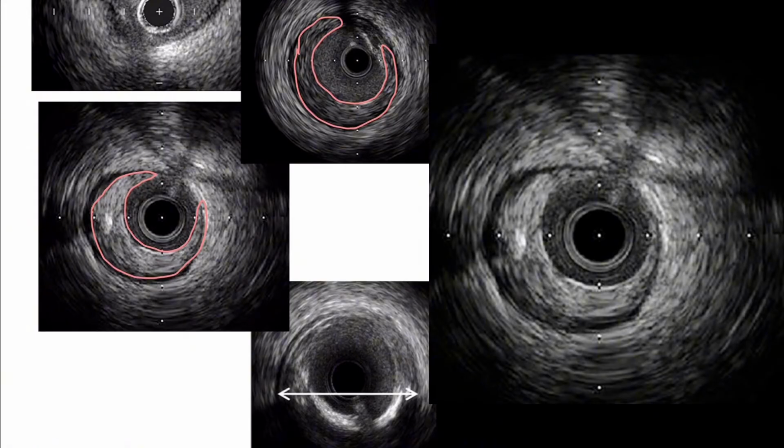All right, well, white, this is a wire artifact, by the way. You see that white deposit? And I know that's wire artifact because, what's this? Right, the artifact behind it. Actually, that's not true. I take that back. The wire artifact's over here because it comes all the way up to the catheter.